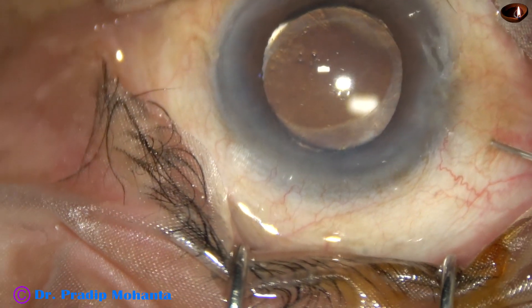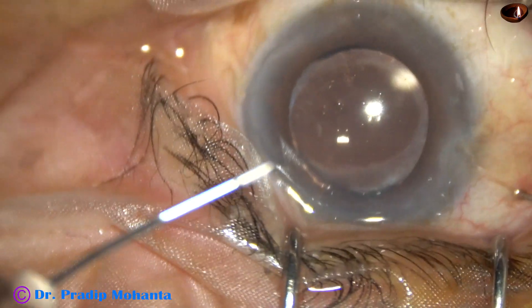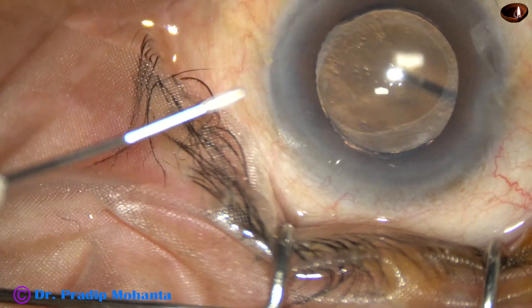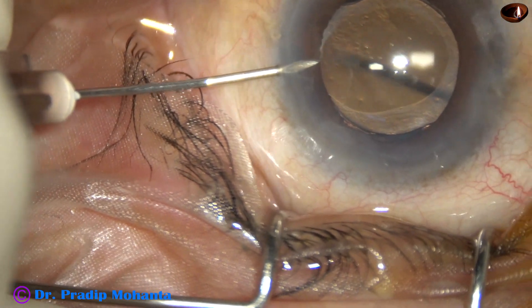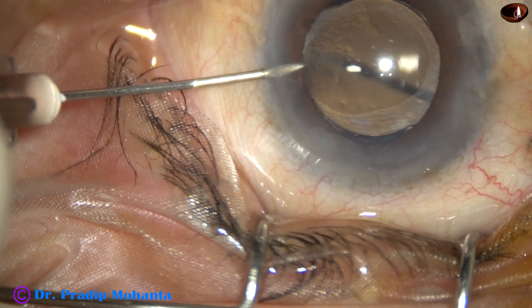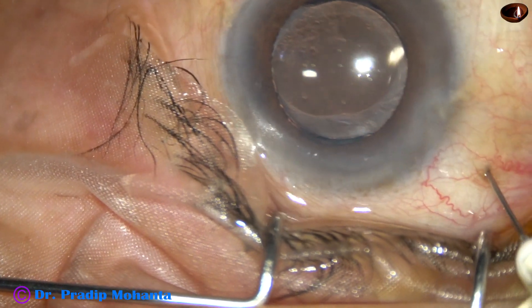This injection is being given with the help of a tuberculin syringe and a 30-gauge needle. As the assistant injects, I introduce this 26-gauge needle through the limbus. Since the piston is not there, the aqueous comes into the syringe and paracentrasis is done.